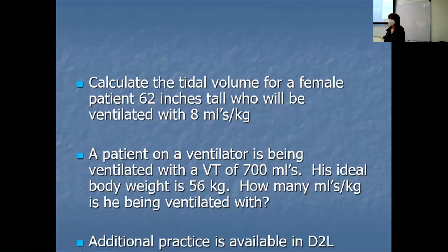Yeah. So that's when you call the intensivist on call or pulmonology or whoever's overseeing the patient and say, we're ventilating with 12 mLs per kilogram. You're concerned about barotrauma to the alveoli. You'd like to reduce the tidal volume and increase the respiratory rate. So that's a conversation you have to have. You don't just say, oh, well, the last shift had it like this, so I'm going to leave it. Never, never, never, because of all the damage that you're doing to the lungs by allowing that bigger tidal volume. You always have to have that conversation.